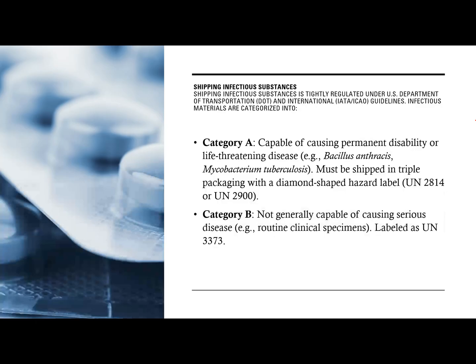Now let's go to shipping infectious substances. So very strict ang WHO dito, class, ang CDC and etc. This is being regulated, class, by the US Department of Transportation and international IATA guidelines. This is an international guideline, class, that all countries need to follow when transporting infectious material. So whenever magpapadala ka ng infectious material via plane, via boat, via ship, you need to follow this standard.